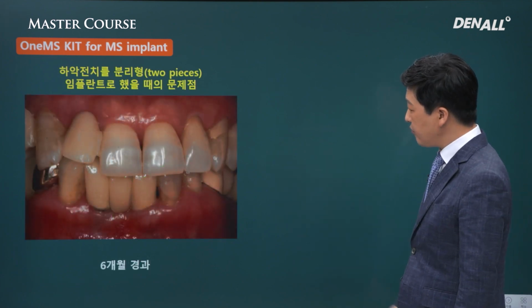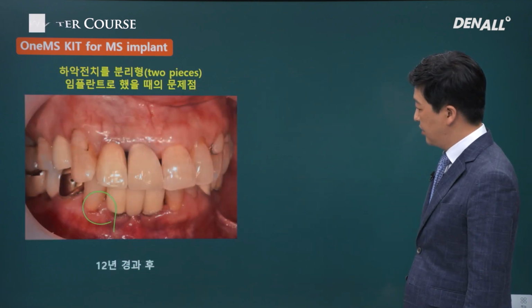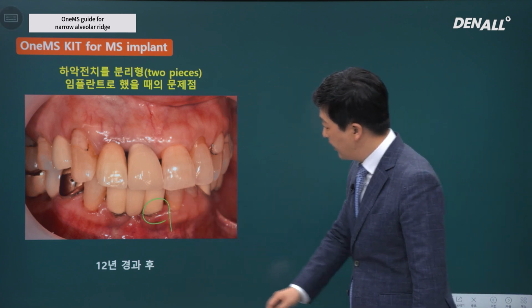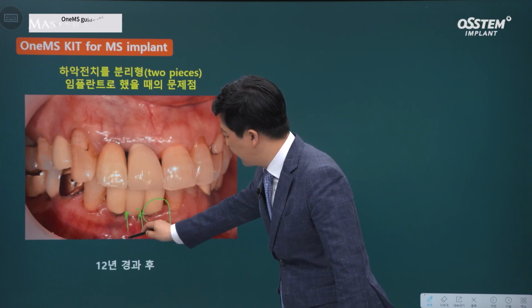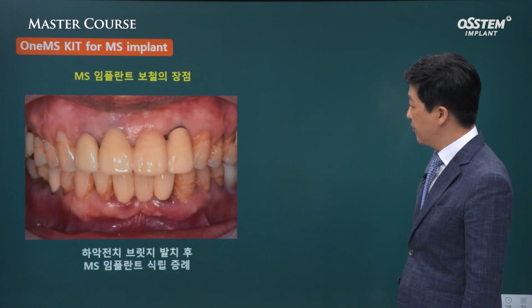6 months have elapsed and you can slightly see through the abutment. You can see that there has been additional recession after 12 years, and in this area, it looks as if toothbrushing will not be easy here.